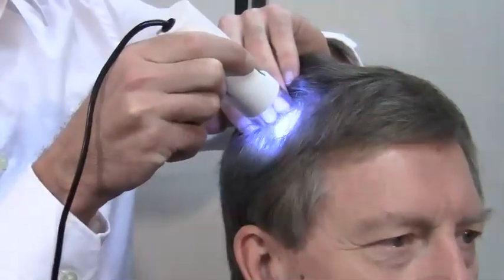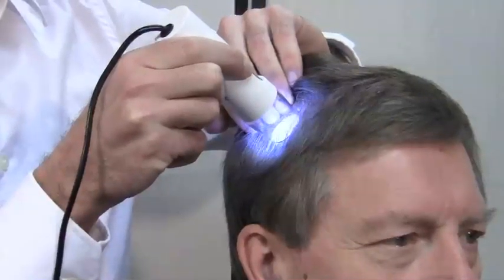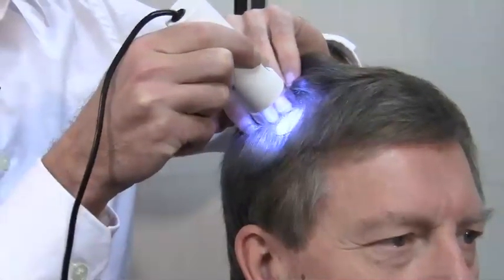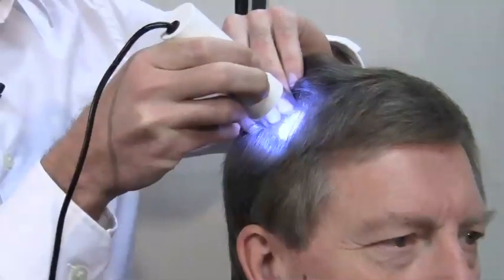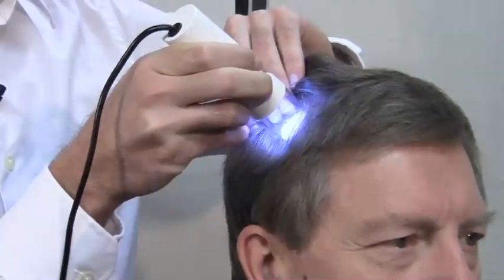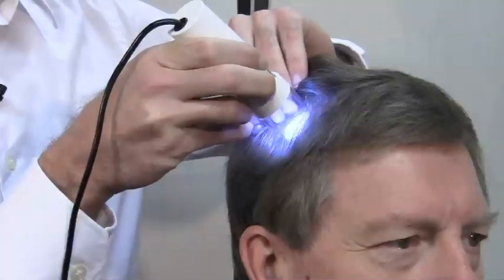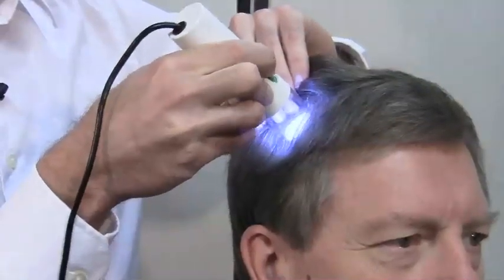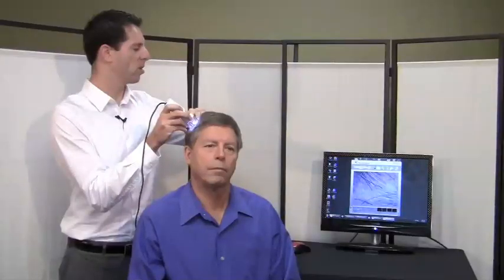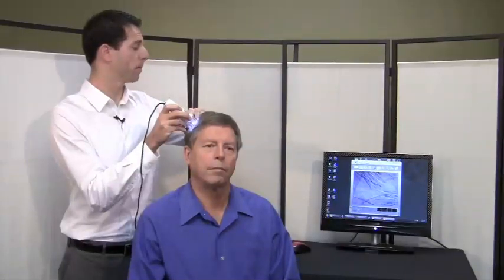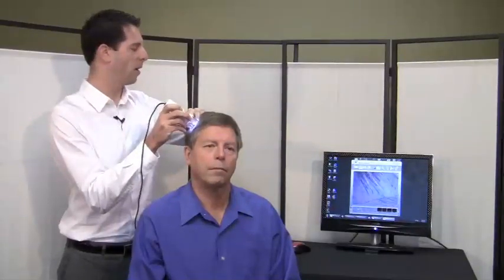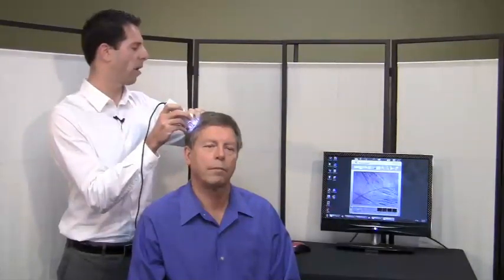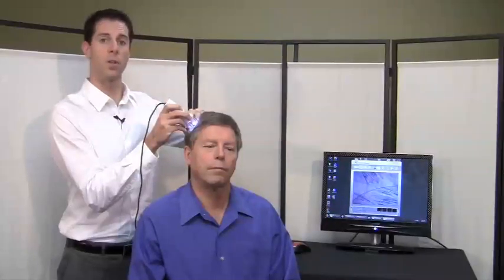I am using the 50x lens for the D-Lite microscope. This is the recommended lens or magnification for examining hair density. So I am just touching the scalp. The D-Lite has a focus ring which you can adjust as needed. You position the tip of the D-Lite microscope directly onto the scalp and adjust focus, making sure that you have a representative area of the scalp and you can actually see the follicles entering the scalp.